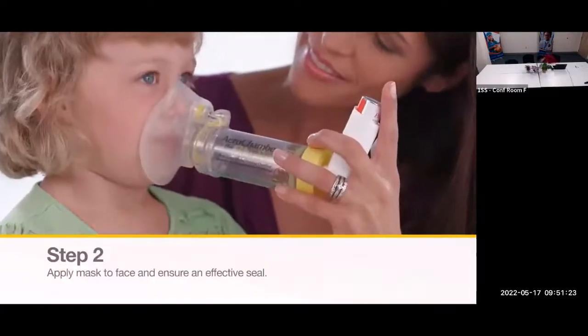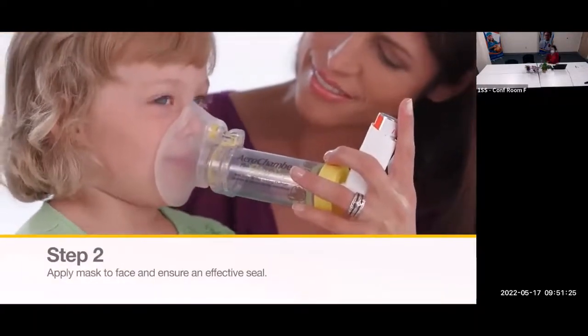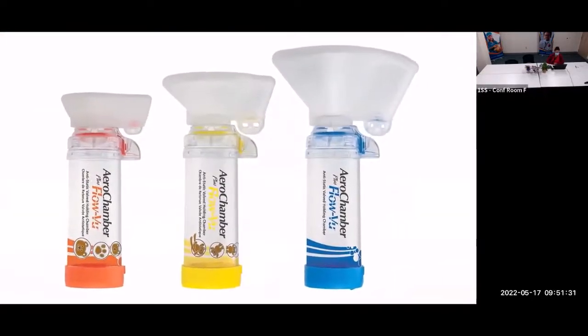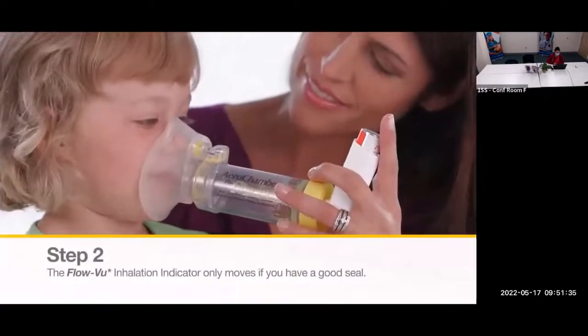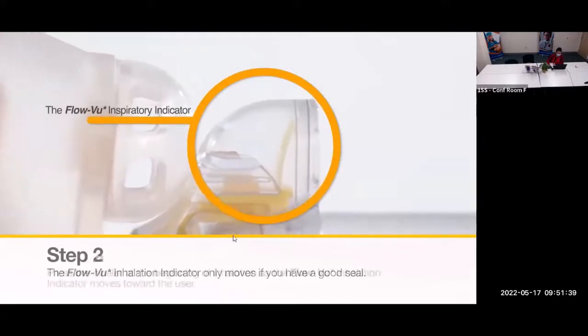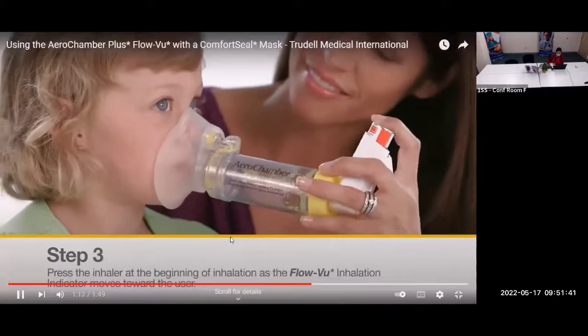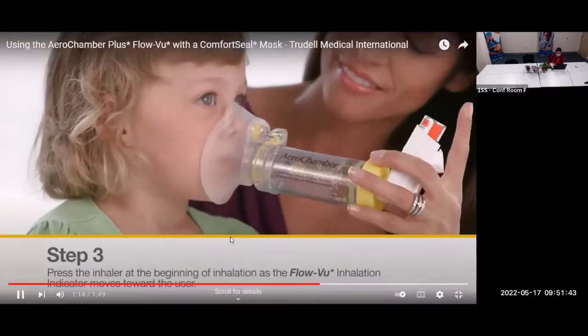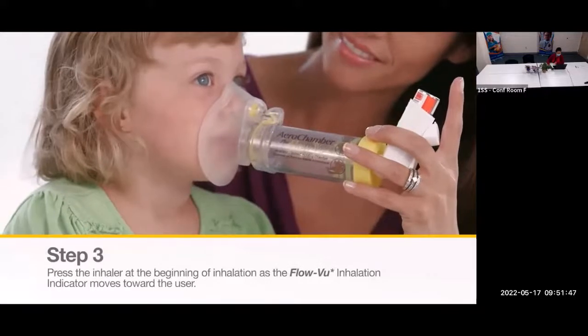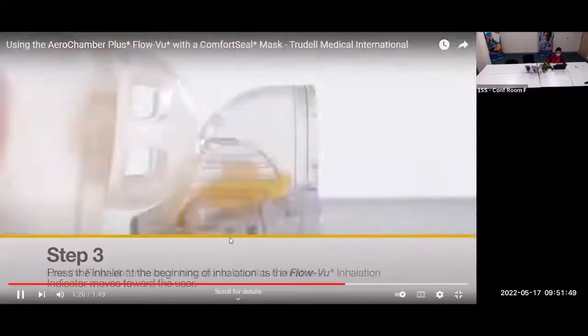Apply the mask to the face, ensuring there is an effective face mask seal. The Comfort Seal mask is latex-free and contours gently to the face. The Flow-Vu Inspiratory Indicator can be used to confirm a good face mask seal. Press the inhaler at the beginning of inhalation. As the Flow-Vu Inspiratory Indicator moves forward, use the Flow-Vu Indicator to help count breaths.